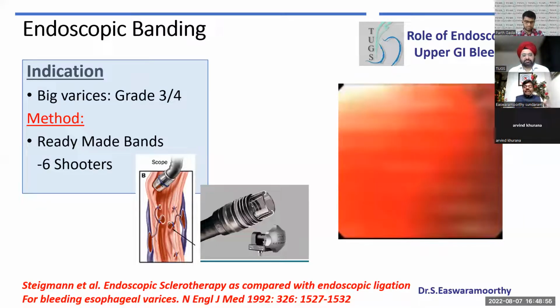You do the dry run because people who do it very well know that when you put on the barrel, the view becomes like a tunnel vision. So vision is poor, especially after putting the barrel. So I waste one or two bands. If I need only 2 or 3 bands, I'll waste the first 1 or 2 bands to test run, and also to get the visibility better.